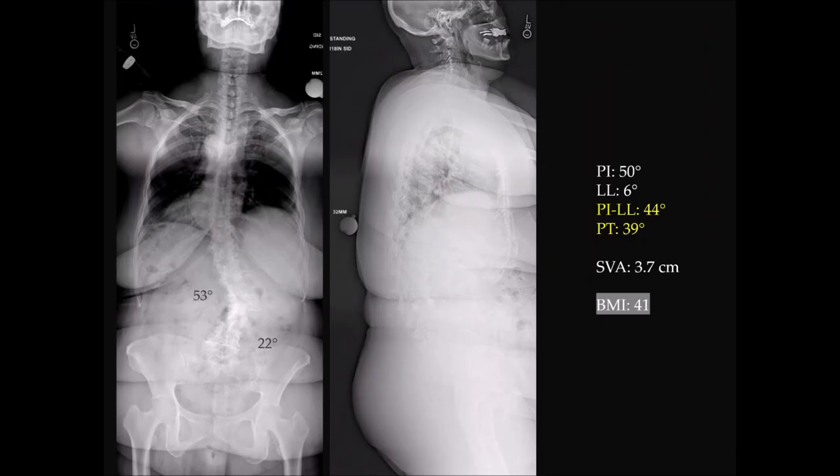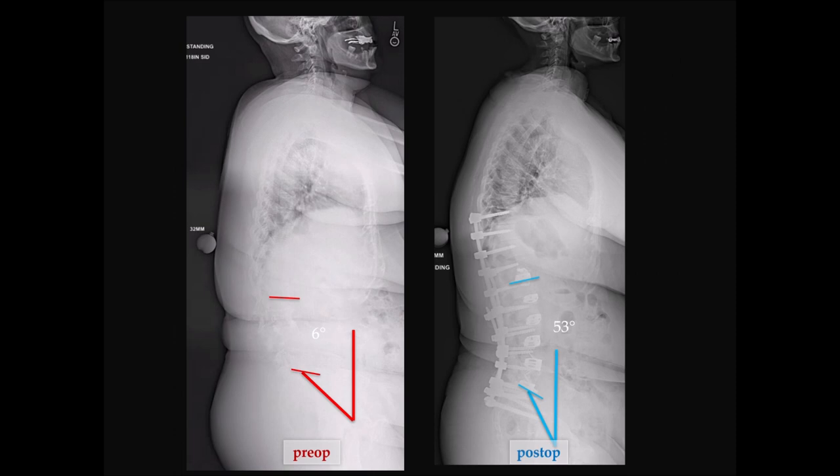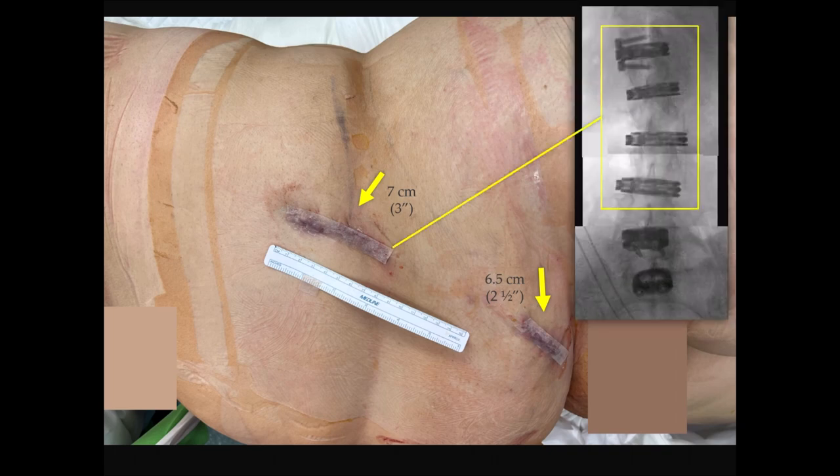The second case: a mismatch of 44 degrees, tilt of 39, and a 53-degree curve. You can see her coronal and sagittal correction here. Again at the bottom, two lateral ALIF cages at L4-5 and L5-1. For a patient with a larger body habitus, this really minimizes the risk profile — a three-inch incision for four lateral interbody spacers, and a two-and-a-half-inch incision for those lateral ALIF cages at the bottom. A really powerful way to correct deformity.